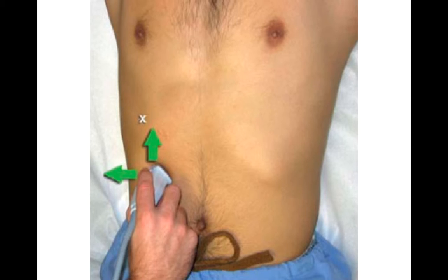If you continue to have trouble, you can place the patient in the left lateral decubitus position, as mentioned before. Another approach is to hold the probe in a transverse view with the marker dot towards the patient's right, and usually this is in the midclavicular line. The probe is then tilted cephalad and caudad to find the gallbladder. It's useful for the patient, again, to take and hold a deep breath to displace the gallbladder below the ribs.